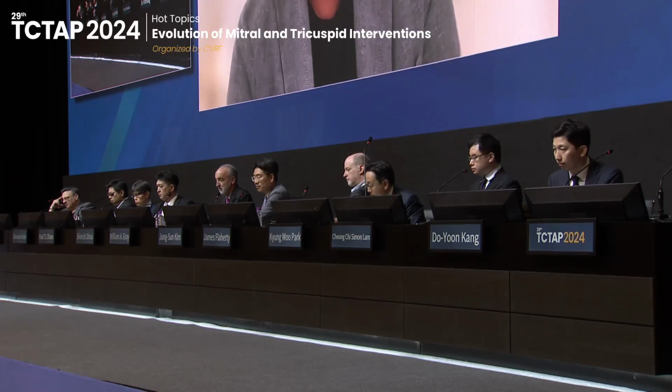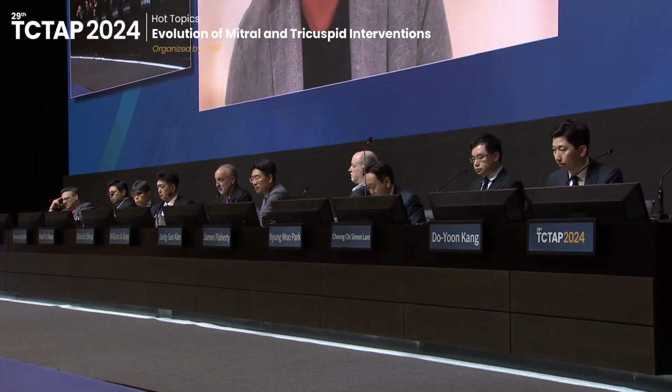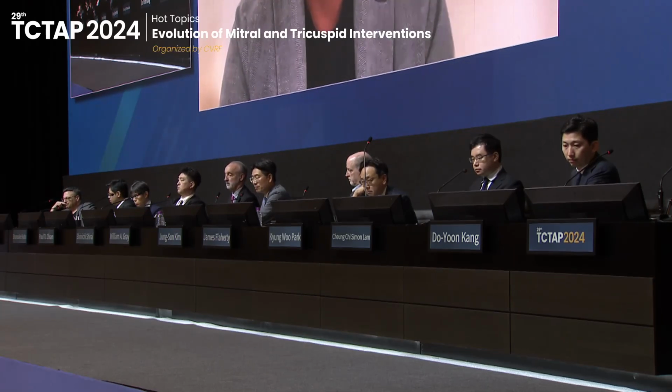And I think if we can eliminate TR in sick patients, those are the ones that are really going to benefit. With a lot of these early trials, what we need to understand is this is such a heterogeneous population. The disease state is really quite variable, from secondary to atrial functional, that we need to be able to better select. I think these data sets are going to help us understand who's going to benefit. We're at that early stage, and hopefully these more complete data sets will help us understand who to treat and how much benefit we can expect.